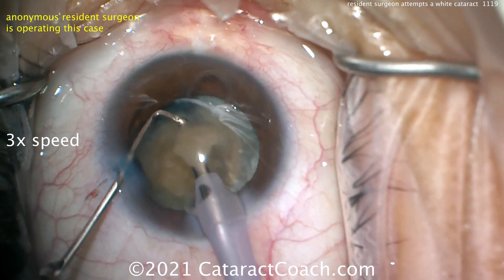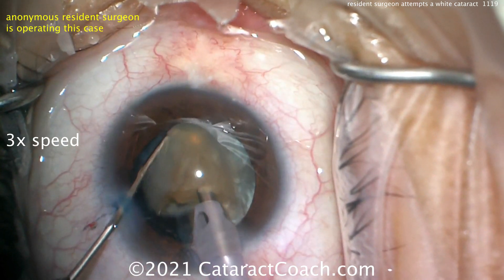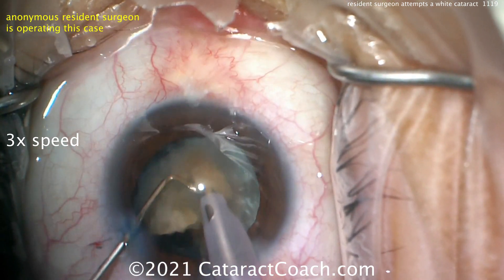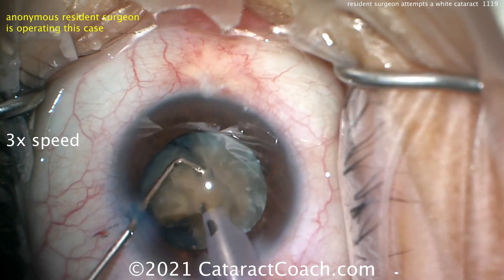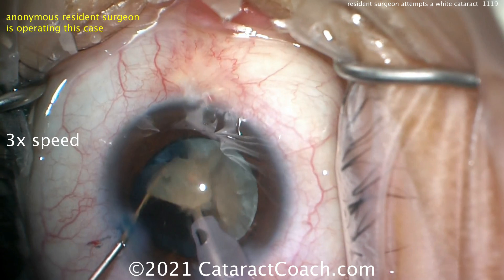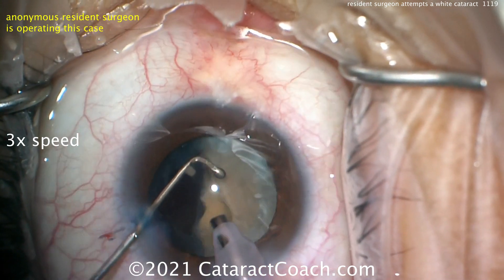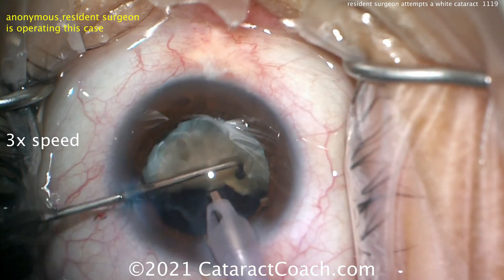Be careful here about riding the corneal endothelium — you don't want to be too close to it. But that's a really nice-looking technique. The remainder of the first hemi-nucleus — another chop — really quite good. Very impressed. Here we go taking down this last little bit.